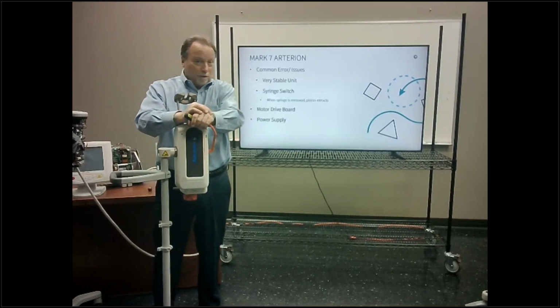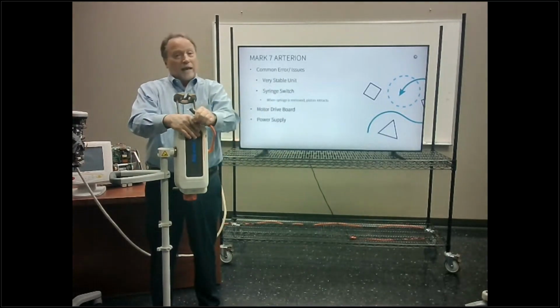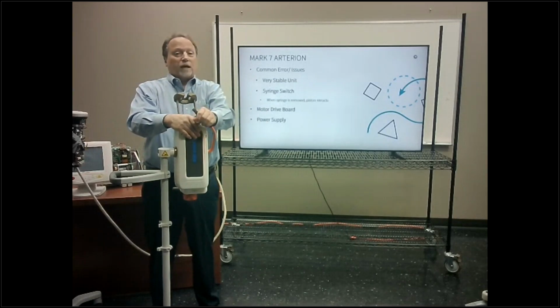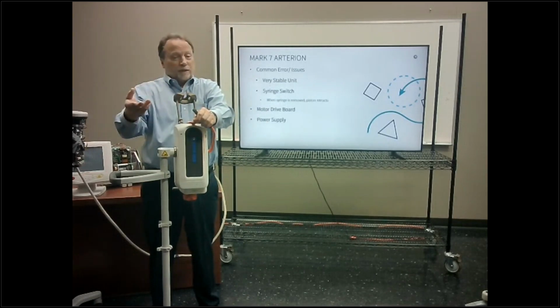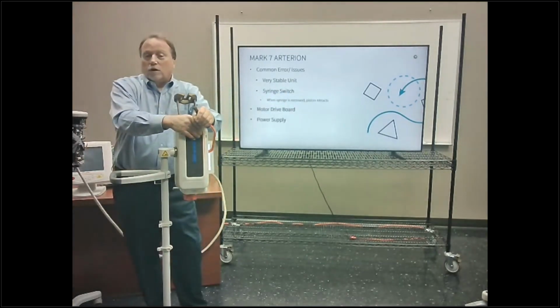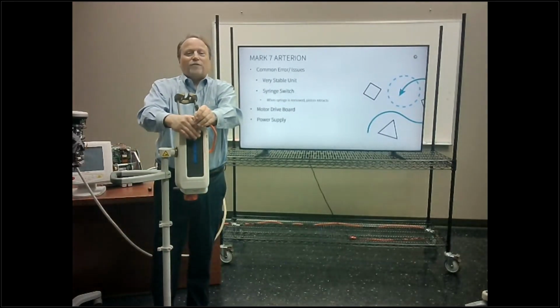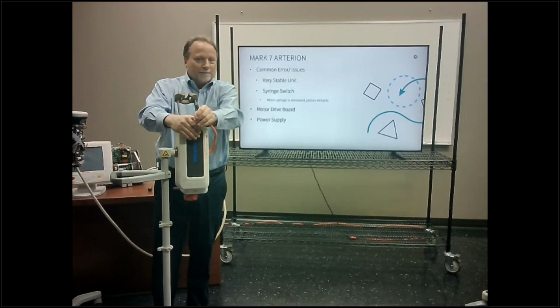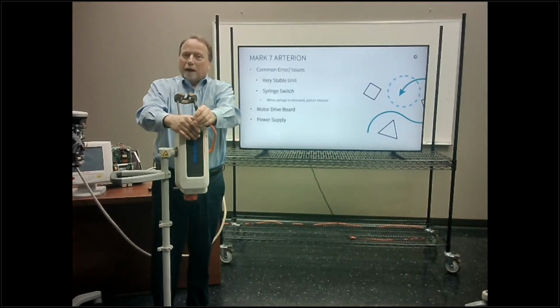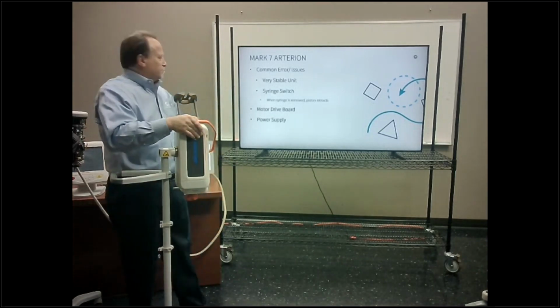Bayer doesn't sell the power modules, they sell the whole power supply. Althea, we do sell the power modules. The power supply is not bad. There's nothing wrong with the power supply. It's the power modules that need to be replaced, and we have them here. There's also a 15-volt power module in there. If you're in there, you might replace all 4. But definitely, if you have a 48-volt power module that goes bad, replace all 3. Or if you want to, it's up to you, replace the whole power supply. But I can tell you right now that the power supply is not bad. It's the power modules. We can find that out the hard way.